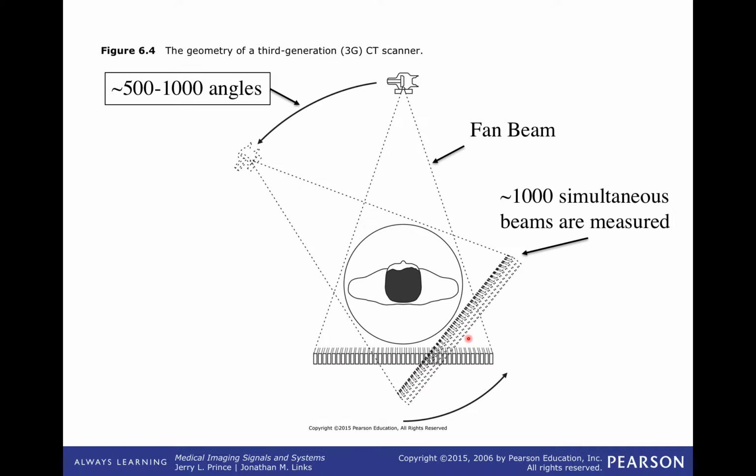And then the next development, or next generation, is if we have a powerful enough source and enough X-rays, put it far enough back such that the beam, the fan beam, illuminates the entire field of view, and then put enough detectors behind such that you get it all in one shot. So you don't have to raster, right?